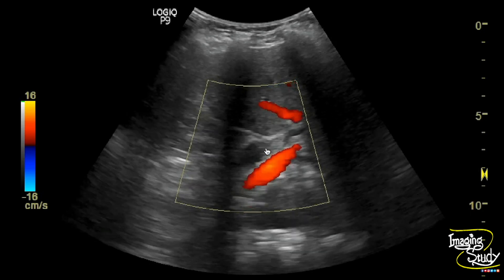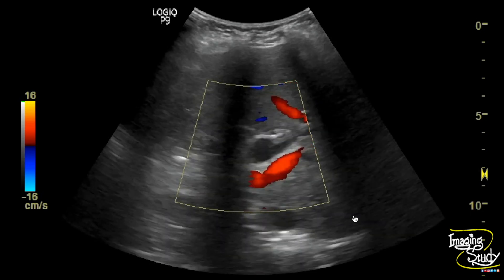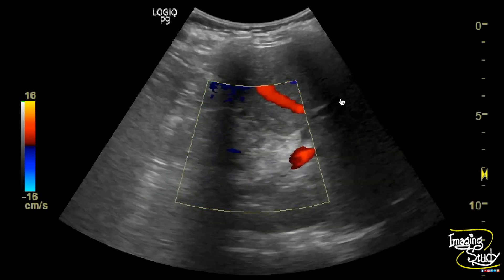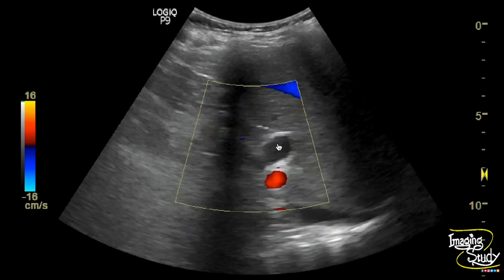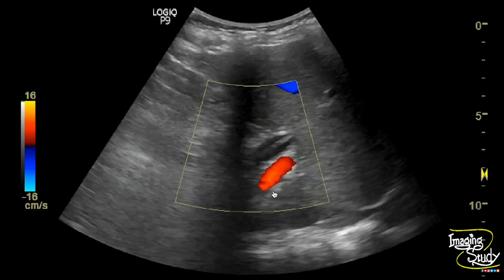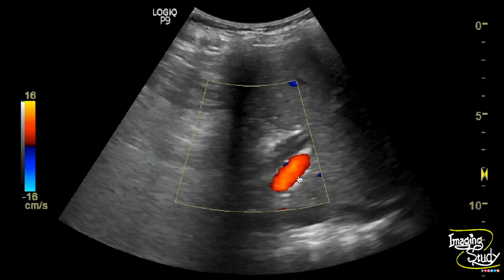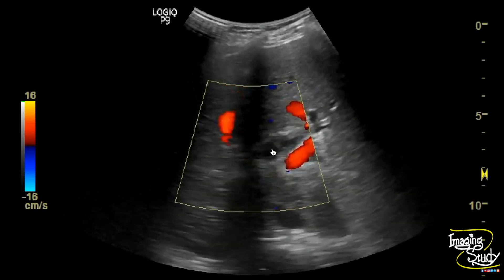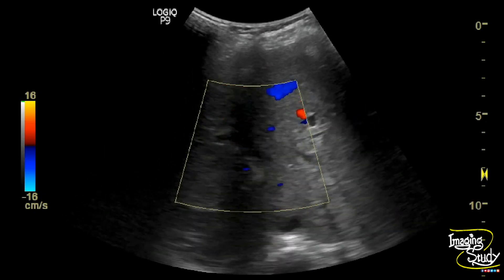Here you can see the common bile duct. This is the portal vein showing color on Doppler, and you can see the common bile duct looks dilated.